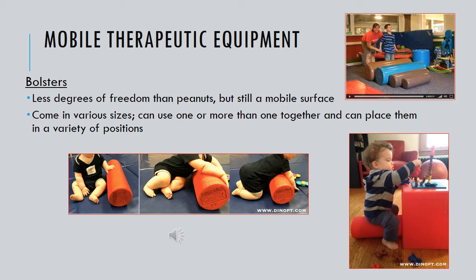Perhaps you have the bolster standing up and you're using it to work on single leg balance for a standing activity. Perhaps the child's trying to kick the bolster over. Maybe you want to work on heavy work and input, so you have the child carrying the bolster from one part of the room to another. There are many different applications in use of bolsters, which we will challenge you to think about and use during lab.